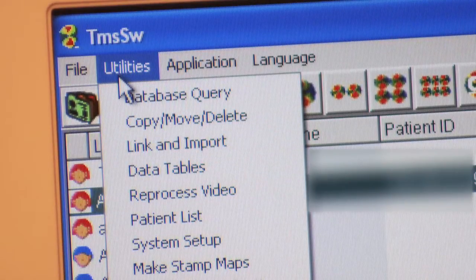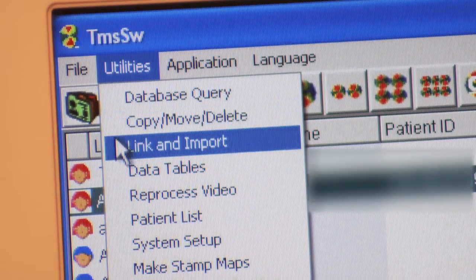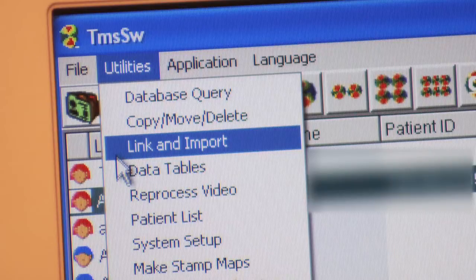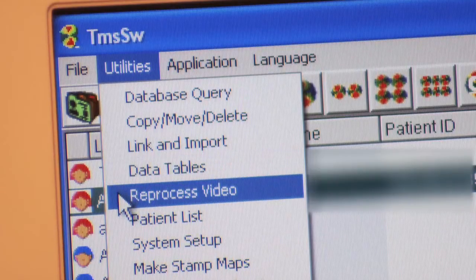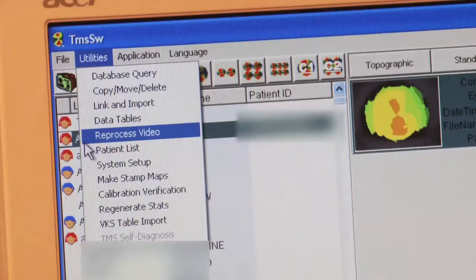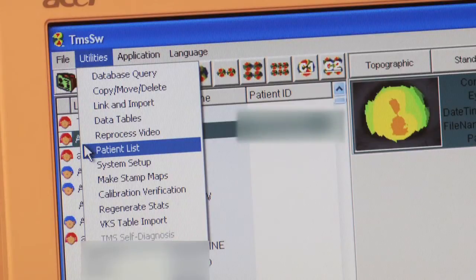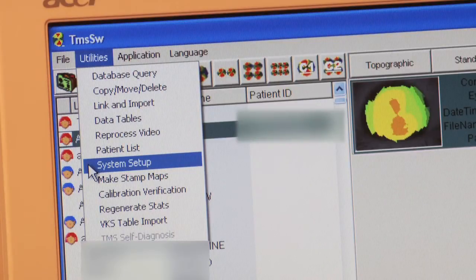The Utilities drop-down menu has 12 selections. Database Query allows you to look at the entries of any individual patient. Copy, Move, and Delete. Link and Import allows you to link up to any database and import data from that database. Data Tables gives access to various data tables. Reprocess Video goes back to the original video image and allows you to reprocess that image. Patient Lists displays the entire patient list entered into the database, which can also be printed. System Setup gives you access to all system settings where you can make changes.